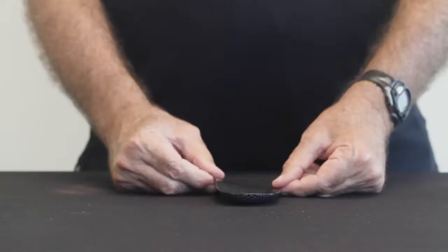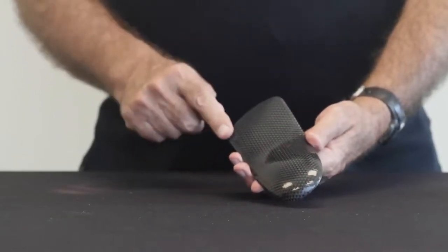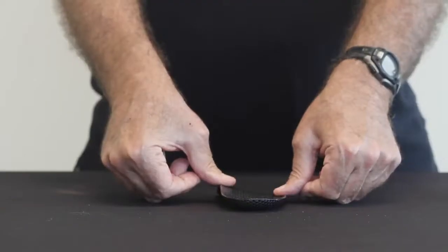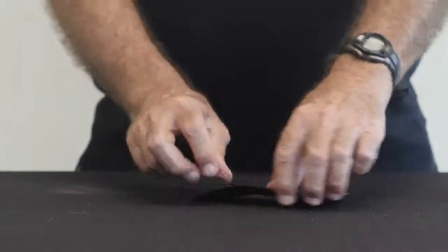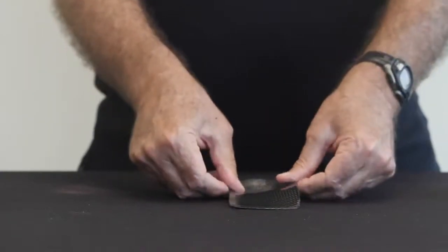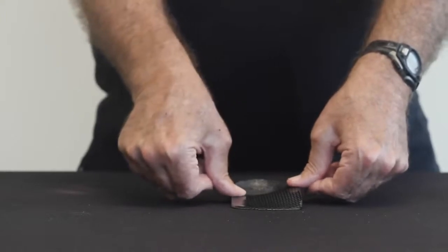We're going to start by evaluating a foot orthosis that has no post — no rear foot post, no forefoot post. Contrary to popular belief, this orthosis, even though it has no post, is quite stable on the ground or inside the shoe. This occurs because the front edge of the orthosis is flat and in total contact with the supportive surface, so that when the foot loads the orthosis, there's no rocking motion.